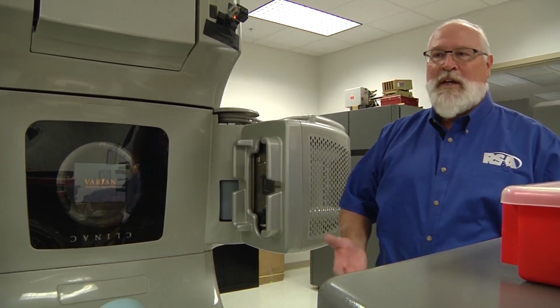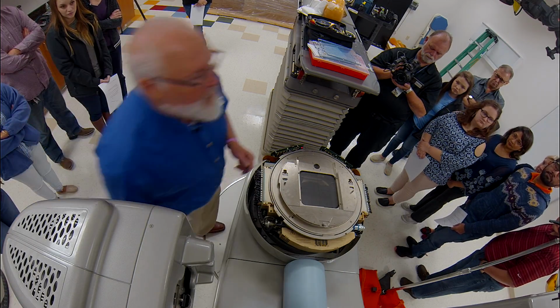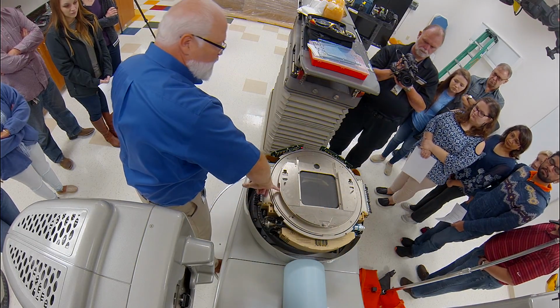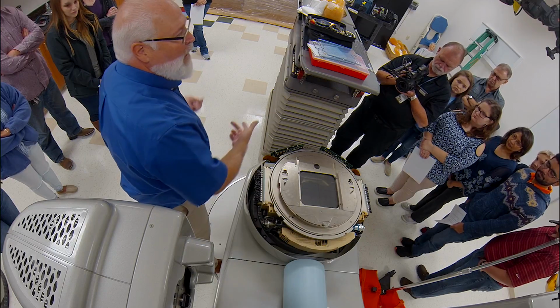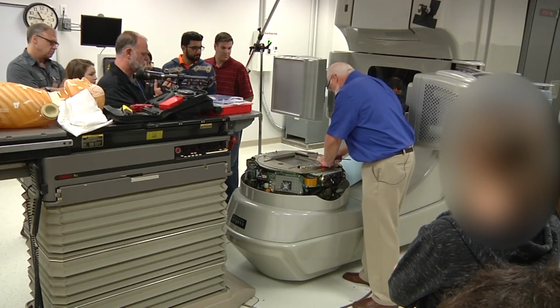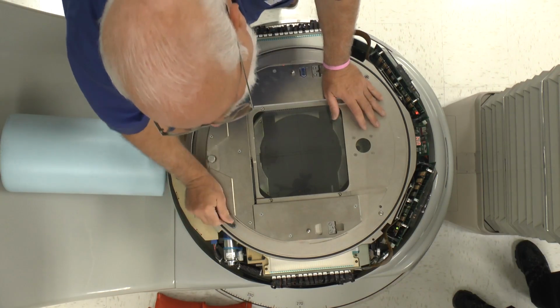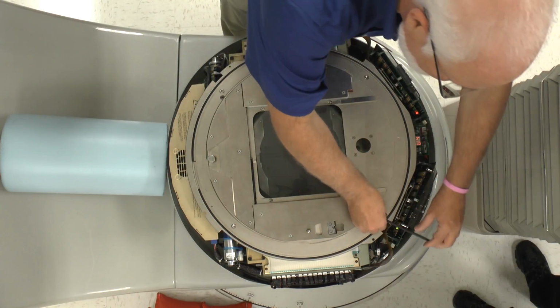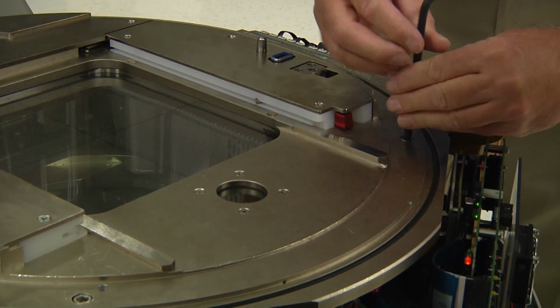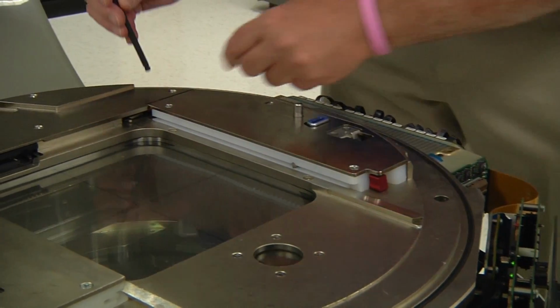So what I do in this case, I'll just hit one of these paddles. I hit this one. Some of the paddles don't work. So that put this red light on. That means now when you grab a pendant, you can't rotate the gantry. To change a motor, you don't always have to take this top piece off. But if you have to replace a T-nut, you will.